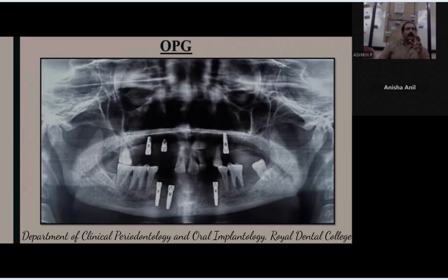So you're going to mix implant with teeth, or are you going to have separate implant supported FPD and the teeth, whatever is remaining, you're going to keep it as it is. It's just an implant supported FPD in the anterior region, and the rest of the teeth you're planning to keep in the same way. What about that 3.8, 3.6 region? Are you planning to rehabilitate it?